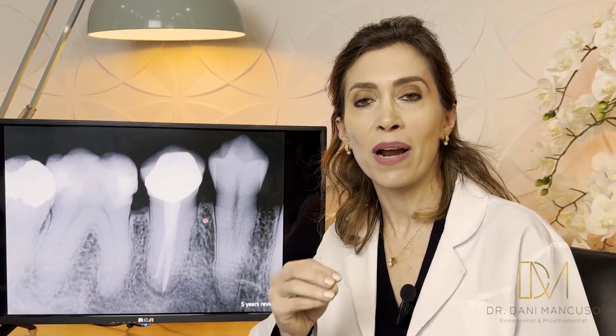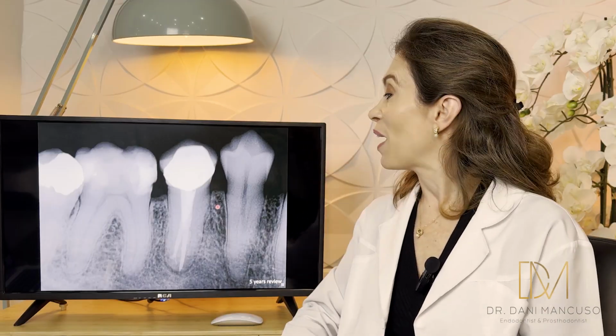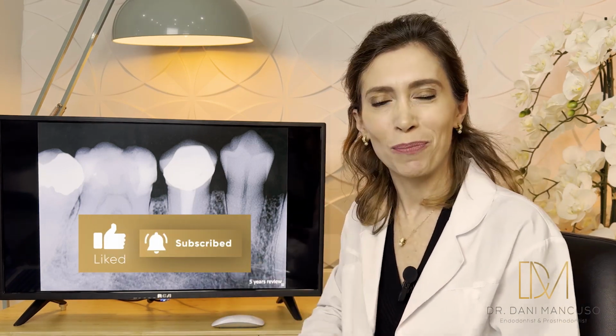So make sure you disinfect it properly. Make sure you don't block those canals in the apical third, because that is where the complexity of your treatment is, and you need to disinfect it properly. Once you do that, you'll be able to see lateral canals. So I hope you have enjoyed this case, and stay tuned because we'll be talking about other topics.